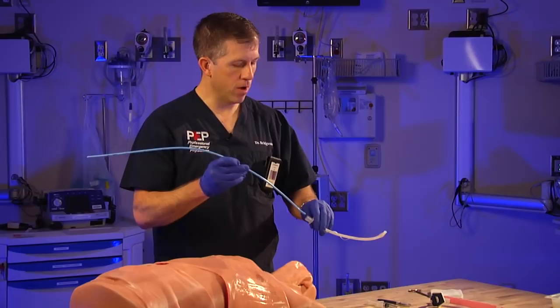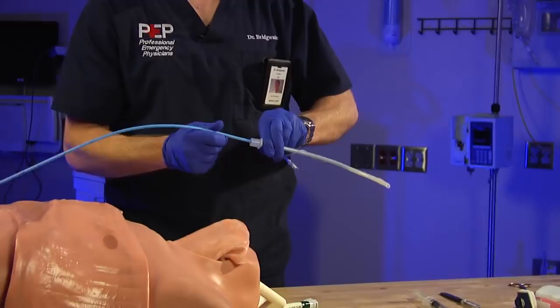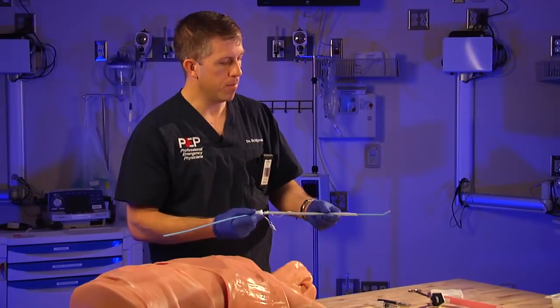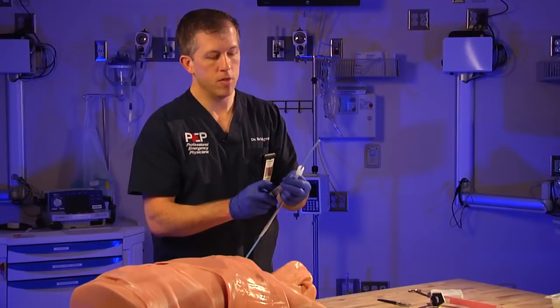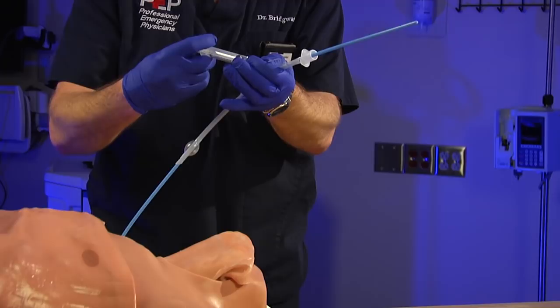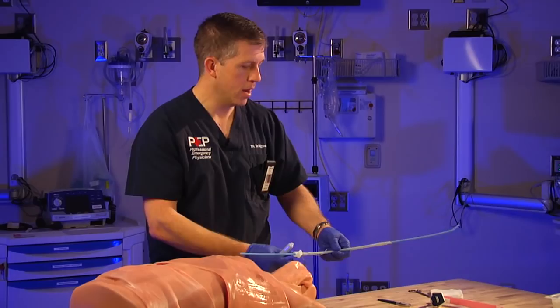It's called the Bougie Cric, so your primary equipment is the bougie. Get it out and preload it onto your endotracheal tube — load it down into the tracheal tube to start. A little saline or lubrication can help this process, but not too much. Just like with oral tracheal intubation, test your balloon first — instill about seven cc's of air, confirm the balloon comes up with no leak, then pull the air back out. Make sure you know where your 10 cc syringe is, and have a scalpel and a securing device ready.